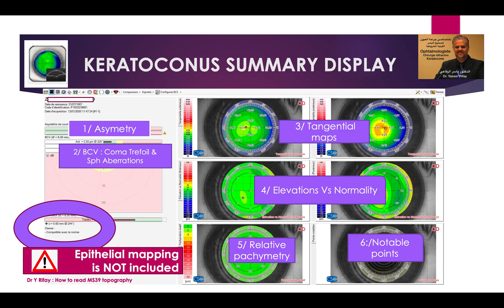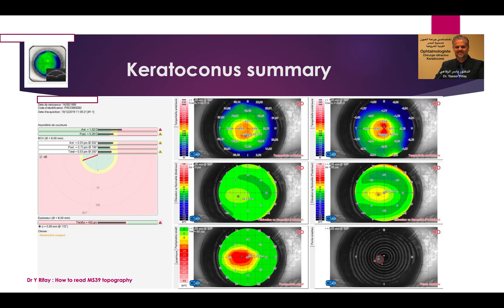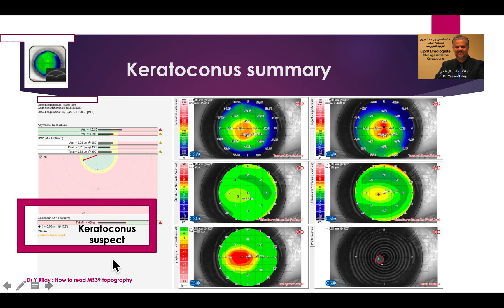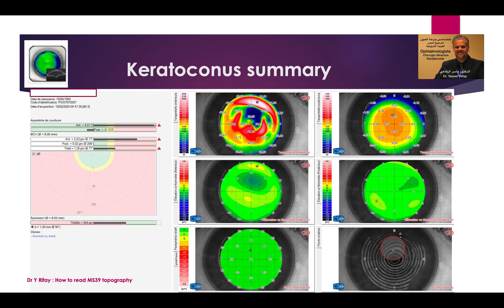This summary does not include epithelial mapping study. It only studies tangential maps anterior and posterior, elevations compared to normal corneas, relative pachymetry, coma and spherical aberrations, and places the notable points in one map to see if they are in the same area. The result can be normal, keratoconus suspect, keratoconus compatible, or abnormal when points are not in the same area.